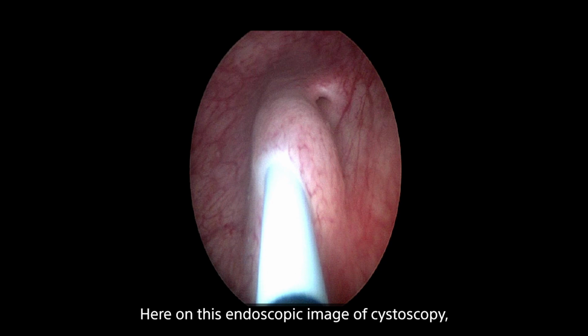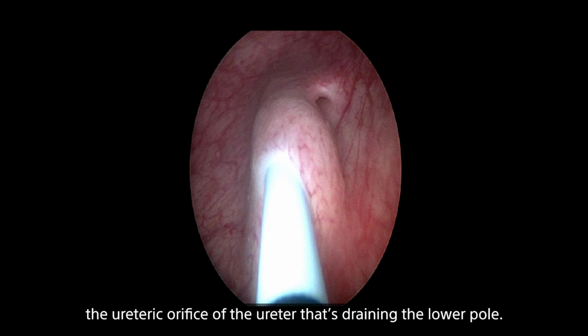Here on this endoscopic image at cystoscopy, you can see that we've got our retrograde catheter in the ureter, which is draining the upper pole. And then you can see just lateral to that, the ureteric orifice of the ureter that's draining the lower pole.